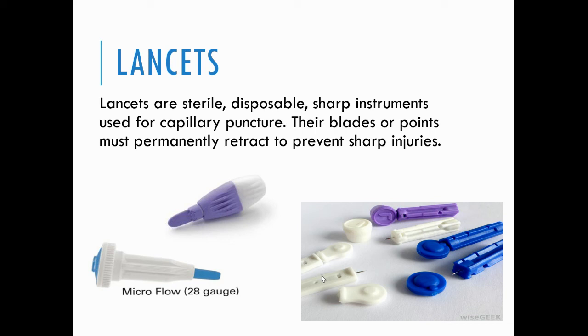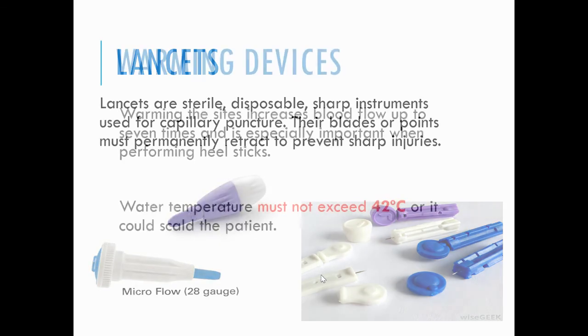So kana siya, lancets are sterile, disposable, sharp instruments, and their blades or points must permanently retract to prevent sharp injuries. So nana siya kana portion dira nga na bevel. So kabalo sa jud ka kung dapat always bevel up nga na mga portion nga na mugamay siya. I know kabalo naman ang term. So musad na i-take note sa nato while performing skin puncture.